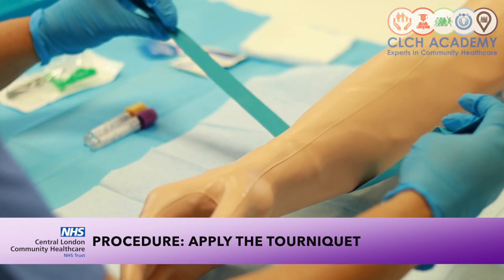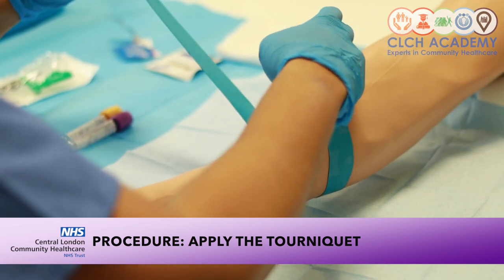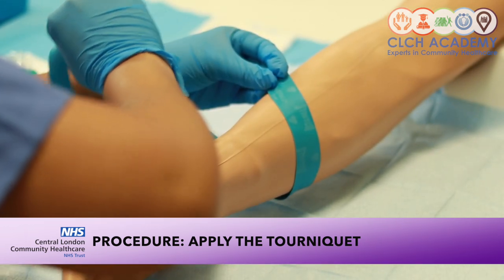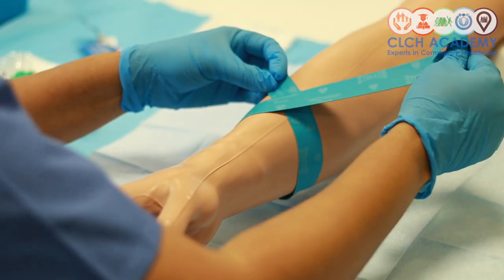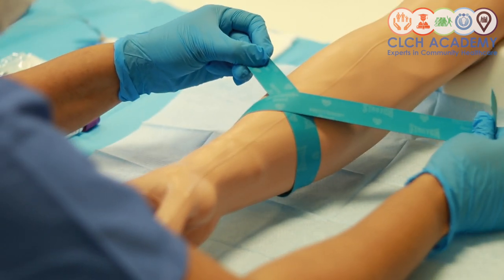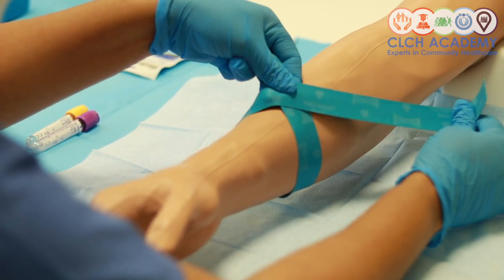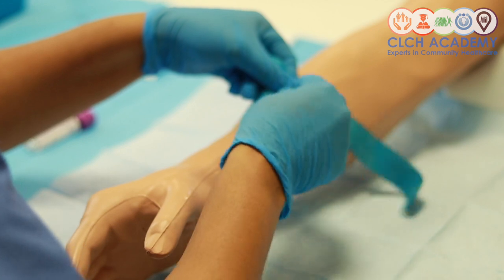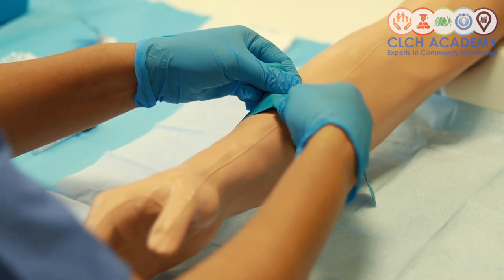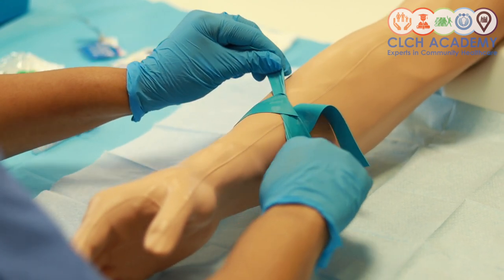Now with the blue tourniquet, there's a slight technique to this one. Once again, I talk about having a long side overlapping a short side and making the letter X. You should still be able to fit two fingers underneath. However, like I said earlier, that's a little bit more subjective, as long as you can still feel for a pulse, that will tell you that you haven't obliterated your patient's circulation.